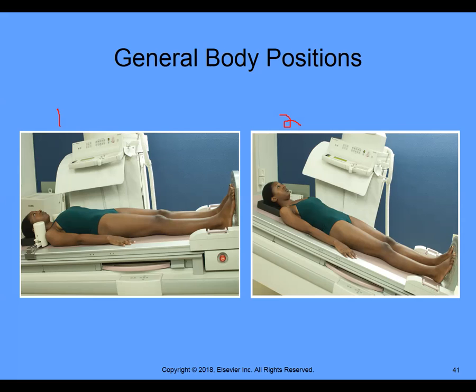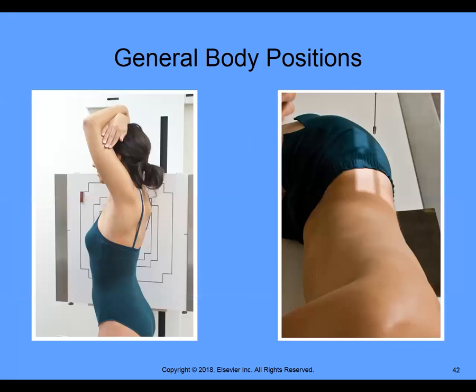And again, remember I told you that we may not have this fancy equipment to tilt the table, but these positions can easily be acquired with us placing pillows underneath the feet to raise the feet higher than the head, or pillows or blankets or whatever to elevate the head to be higher than the feet. Again, we're looking at positions. We're not looking at projections.